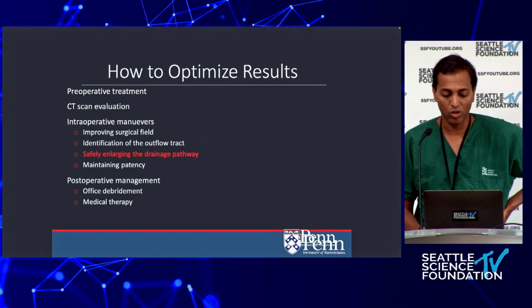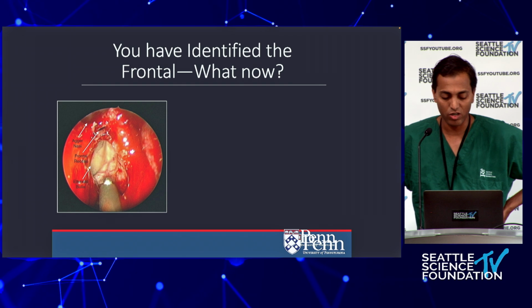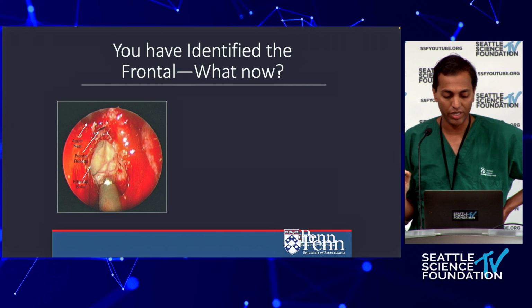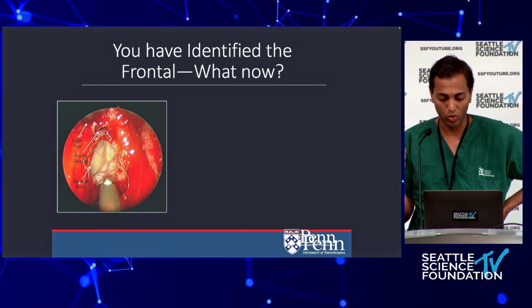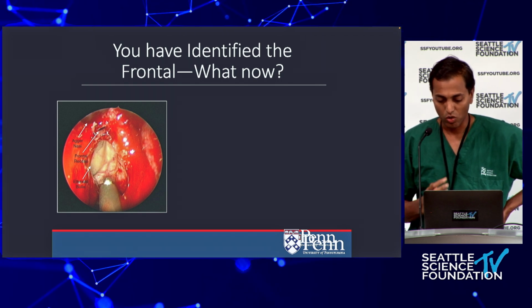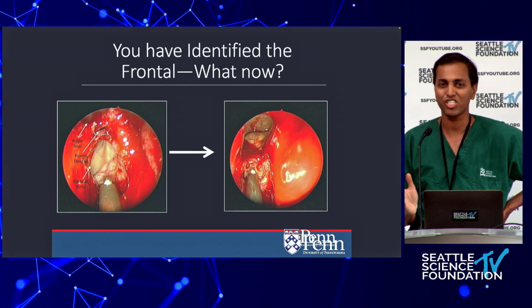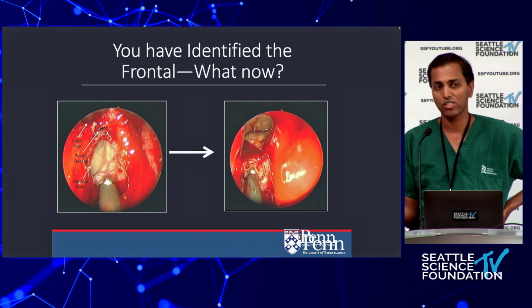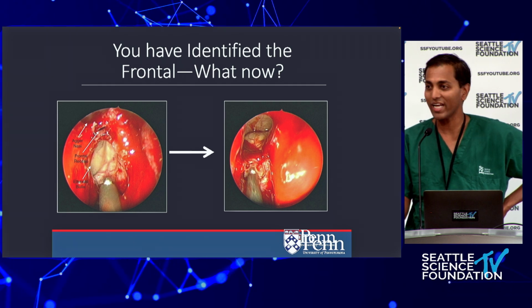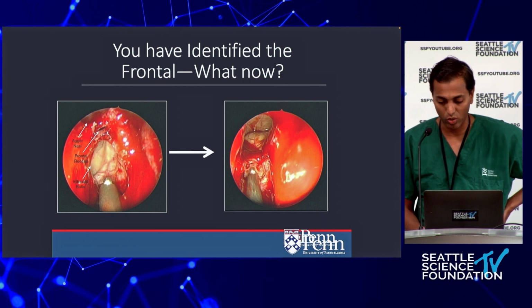And once you find the frontal sinus, well, how are we going to enlarge it safely? So this is a nice one. One of my mentors used to say that the frontal sinus recess pathway is where you see it's right dark right there. And so once you see that area, if you know your anatomy here, we're like, okay, there's got to be an agger in front of this, and there's that suprabulla cell right behind it. So how can we open these? To get to this phase, I like to work anterior to posterior. Again, anterior is always safe. You literally can take an instrument against that agger and that frontal beak, and you can pick the patient's head up off the bed with that anterior beak, and you're still safe. Posterior, you've got to be more careful, obviously. So that's why I like to always go anterior.